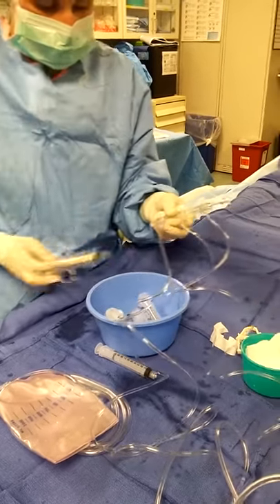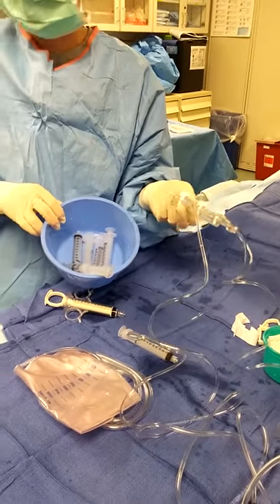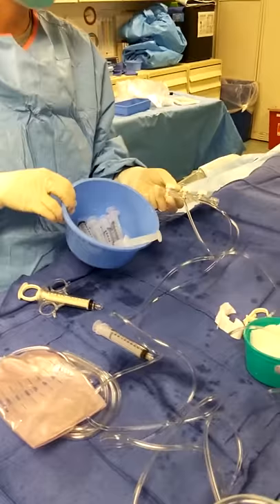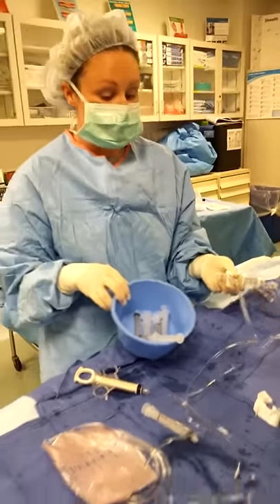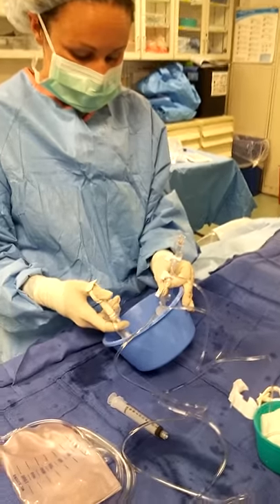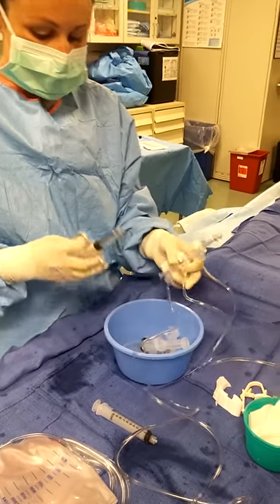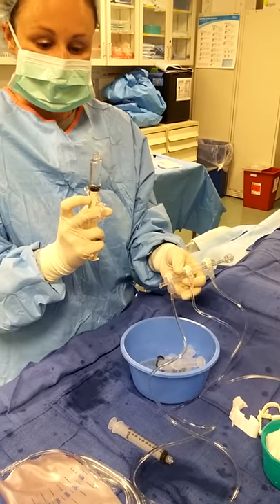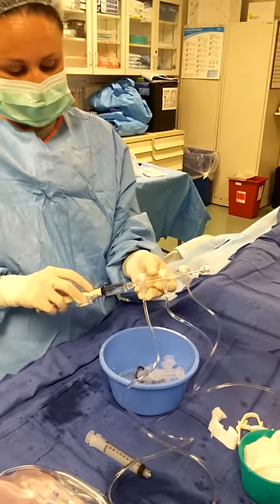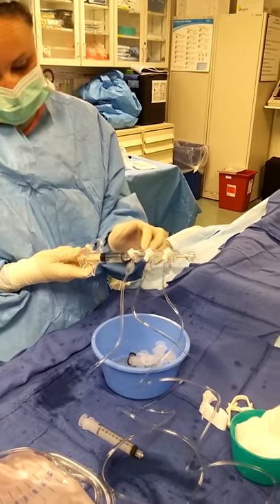Technically, I have a little flush in my bowl, so I could technically flush my syringe, my Seldinger needle, and some other equipment if need be. But now I need to put the manifold on the lap of the patient and prove to the physician that it is air-free. Fill the control syringe with seven to eight cc's. Yes, that's how you want to leave it.